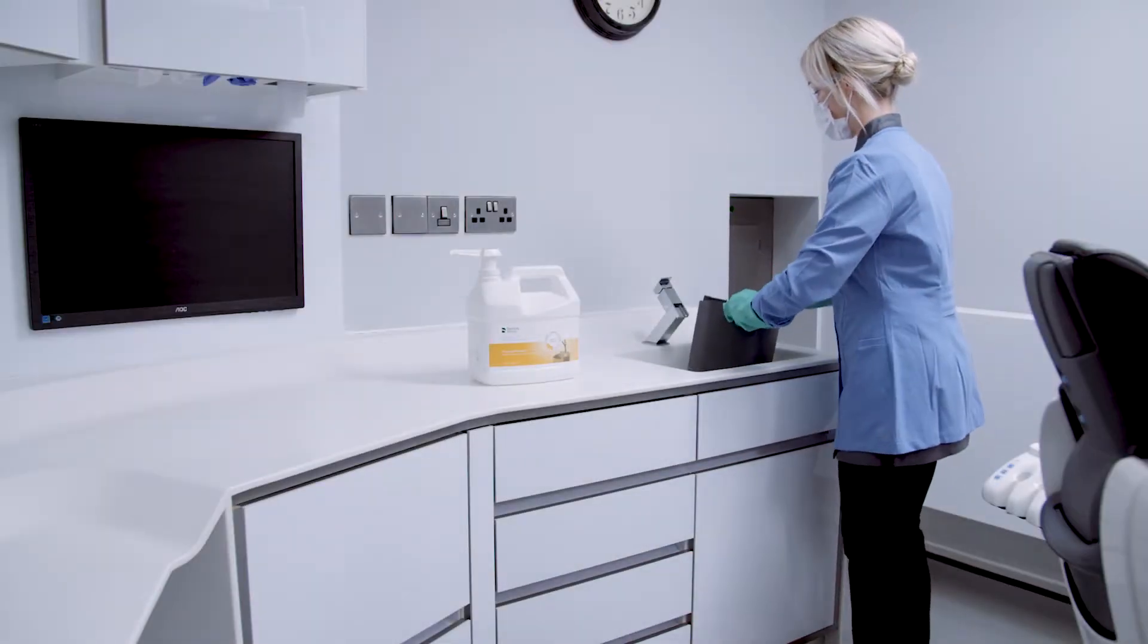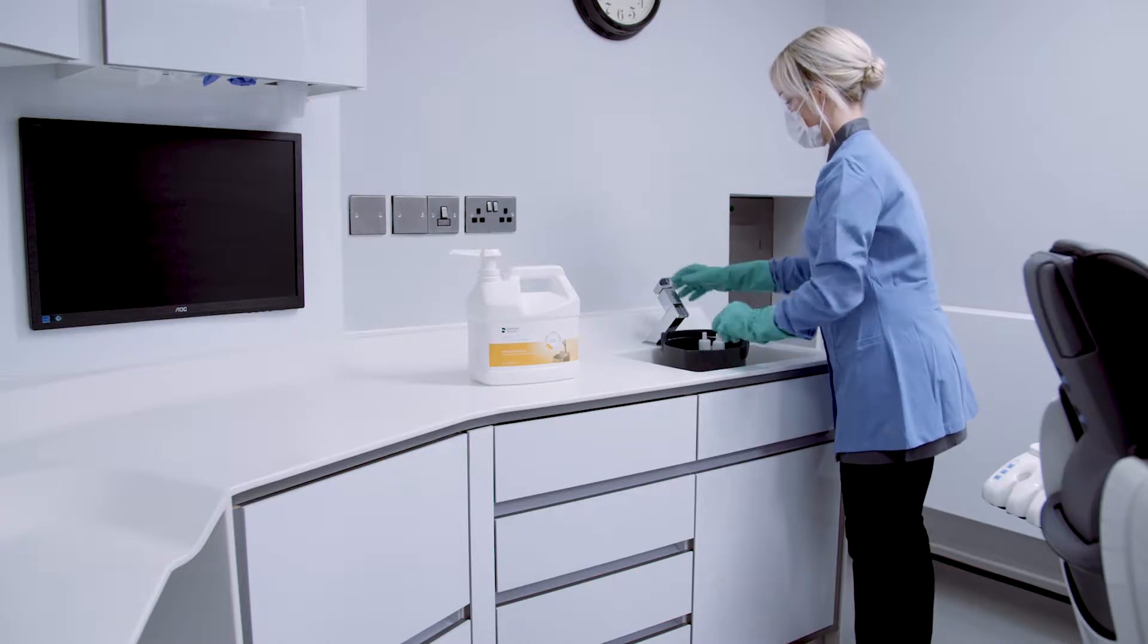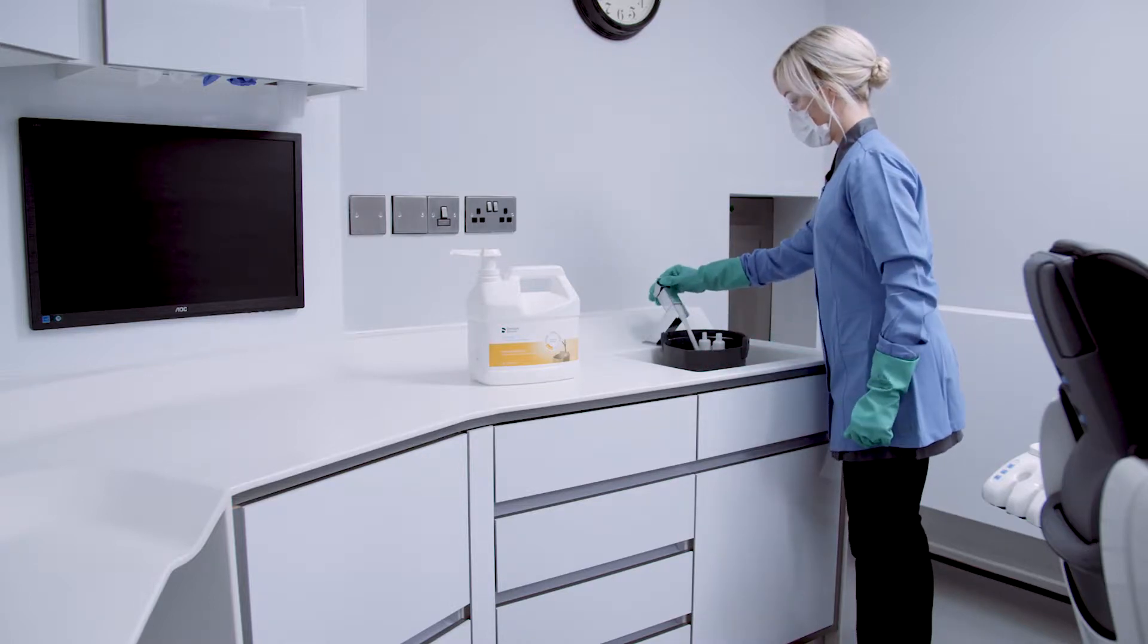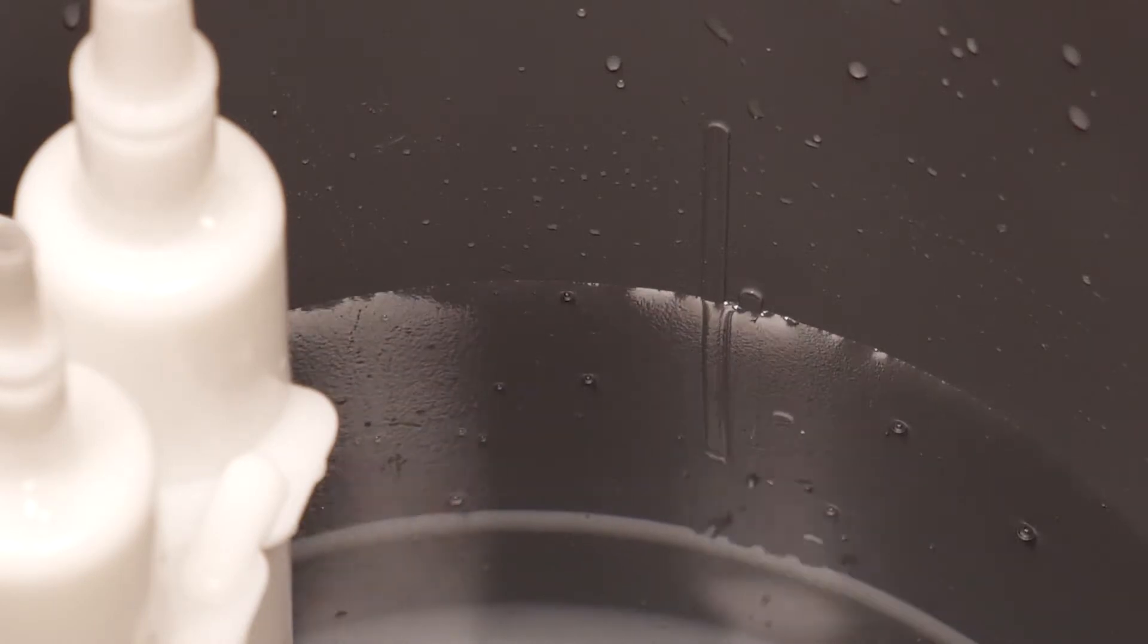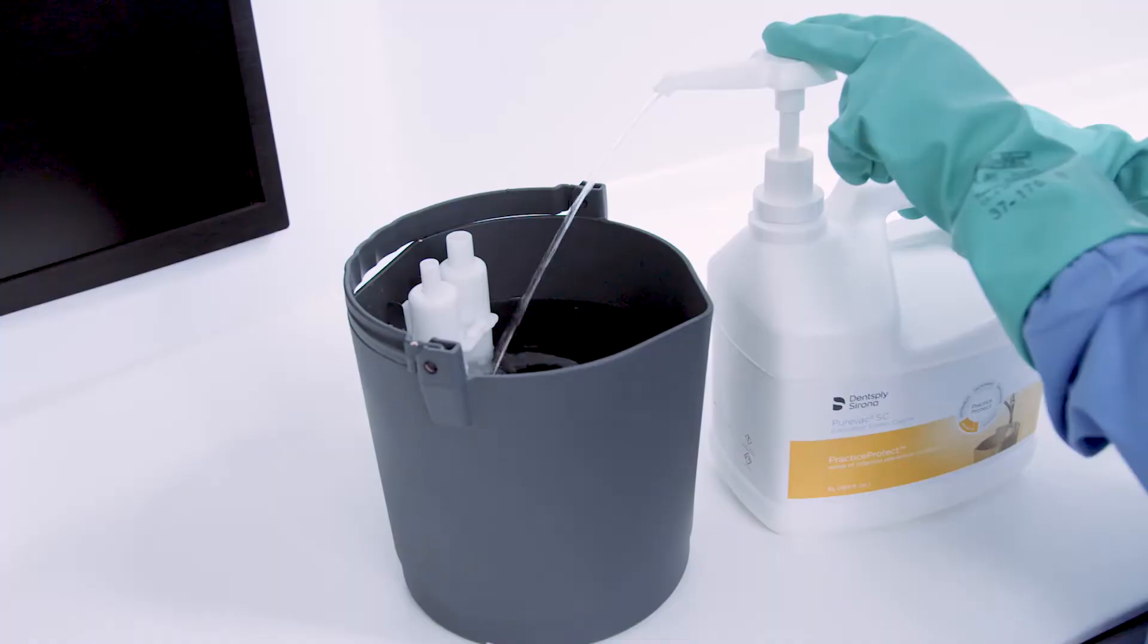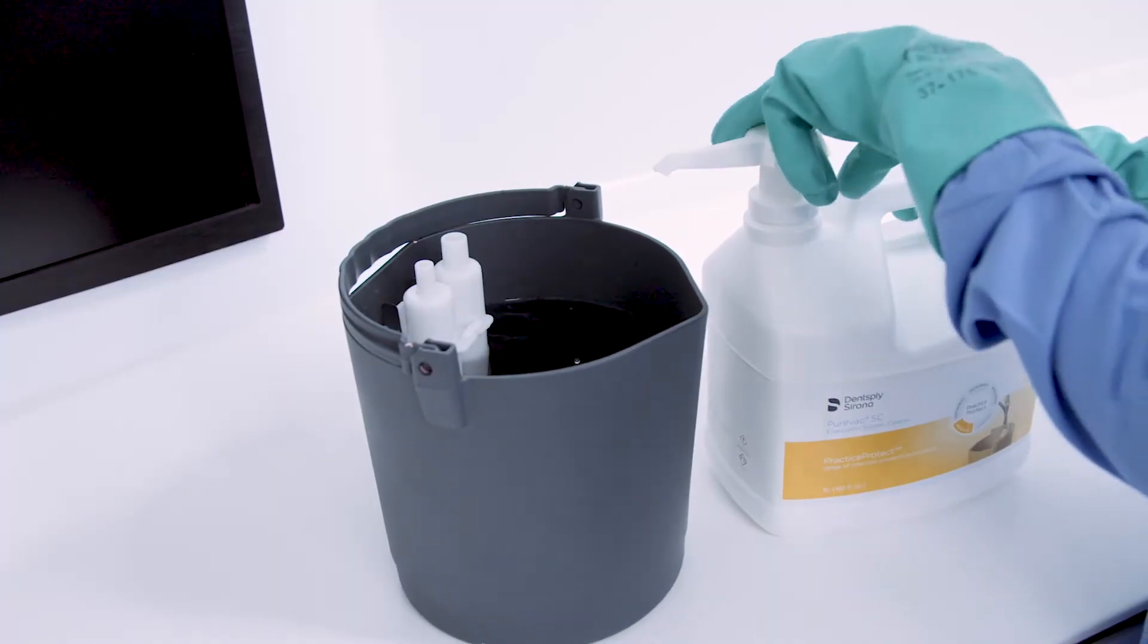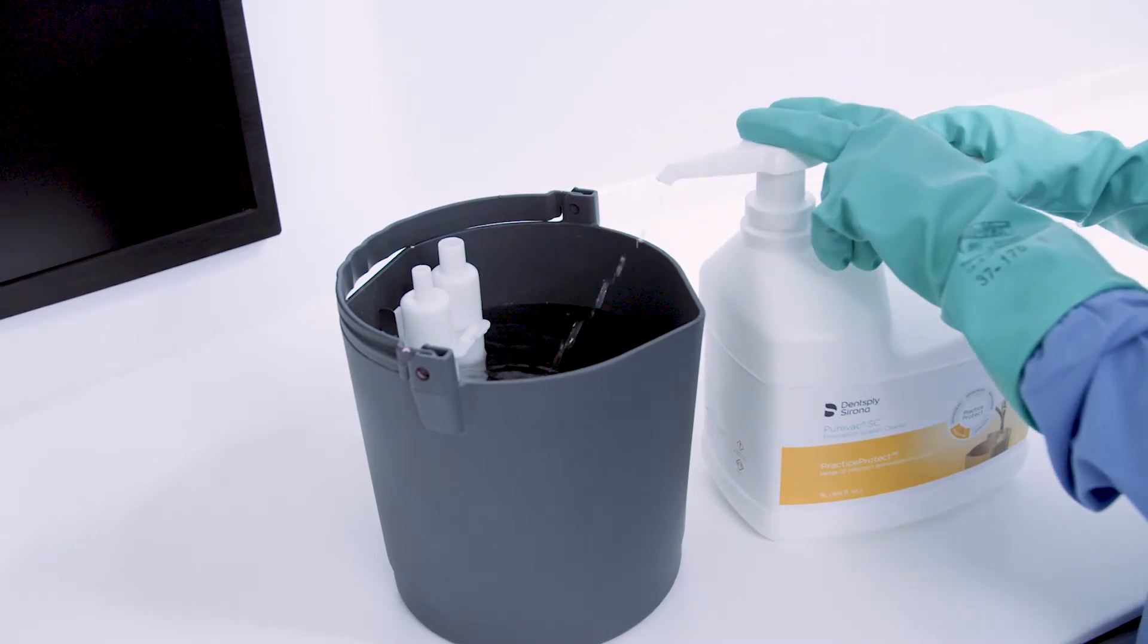At the end of each day, begin by filling the dispenser with one quart of water per operatory. The dispenser has markings that indicate proper water level for a total of four operatories. Press the pump on the PureVac SC container one time for each operatory to dispense the proper amount of cleaner into the dispenser.